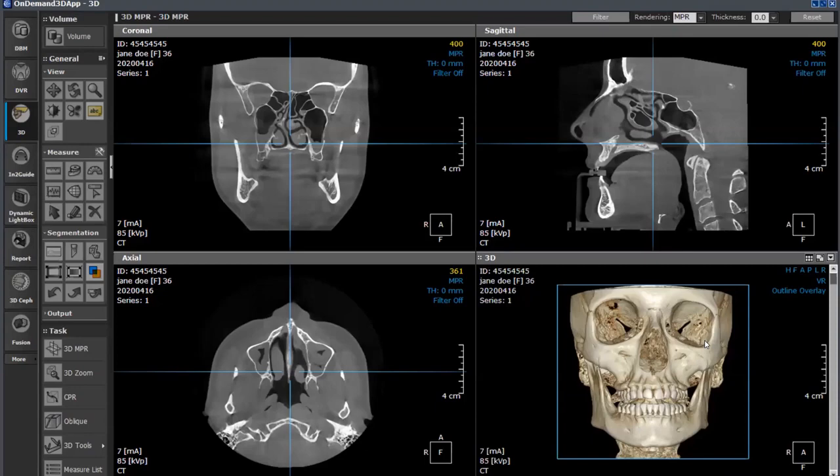So another question is the smallest voxel to be captured. With voxels, ours goes down to 0.1 millimeters. That is the smallest that we have. Now, you may be seeing in the marketplace, you hear people talk about that they have something like a 0.08 or 0.07. We didn't choose 0.1 because we couldn't go any further. We did it because at a certain point, you're going to get more signal to noise ratio as you get into smaller and smaller voxel points. So we chose a clear voxel point and something that our algorithm can then make into clear pictures.